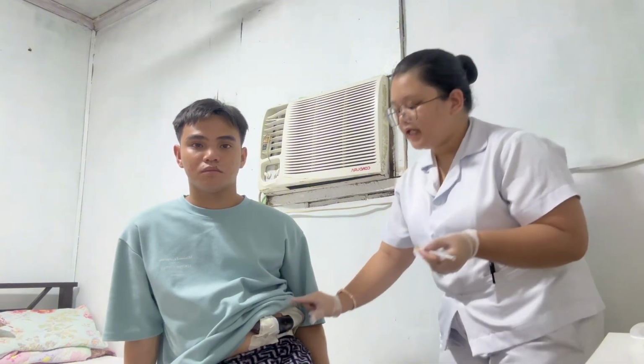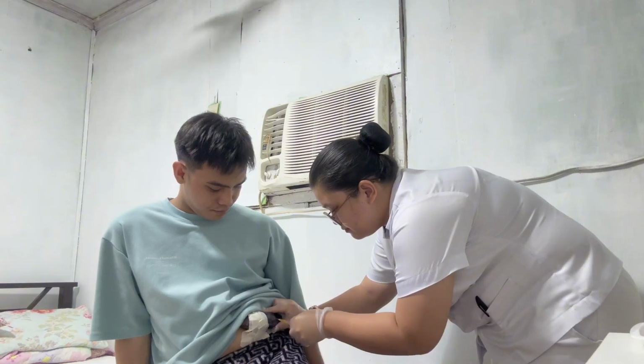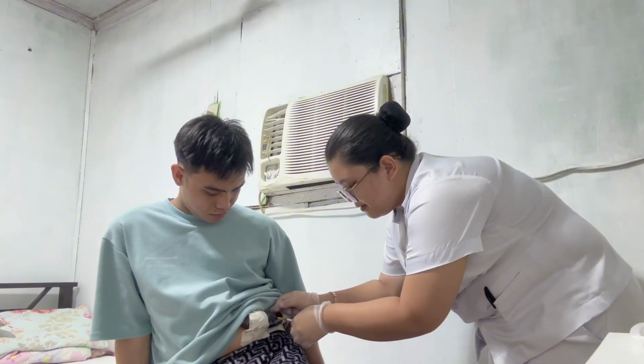Now, I will be injecting by pulling the skin of the patient. So I'm going to insert the needle now. After injecting, we're going to remove the needle just the way we pulled it as we entered it. After that, I will put the cap on the needle.